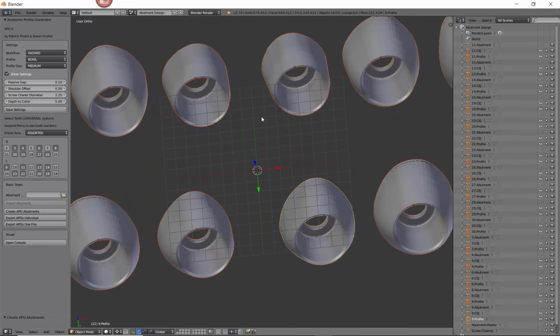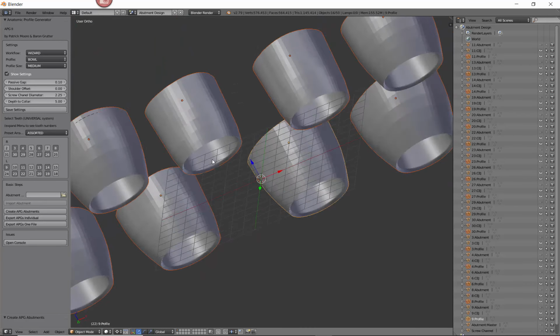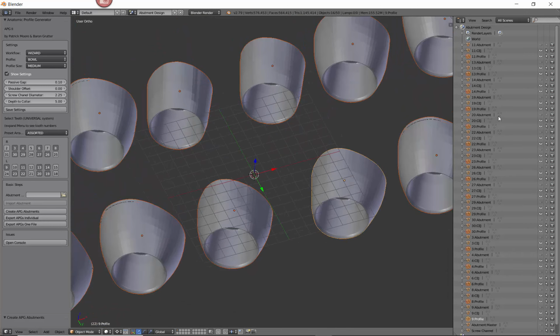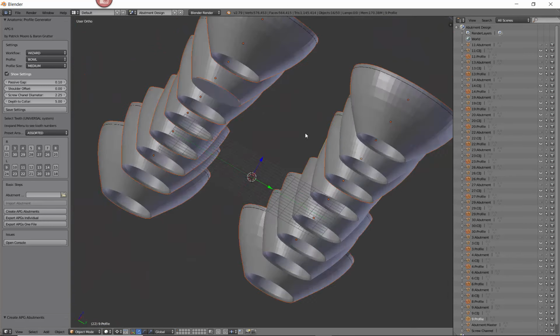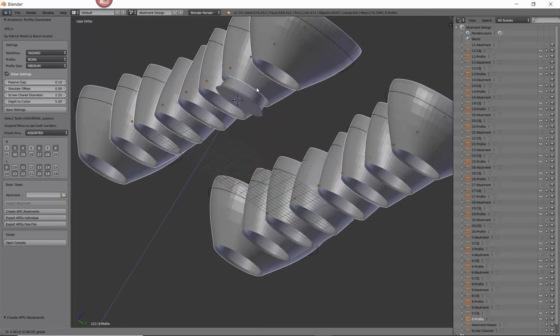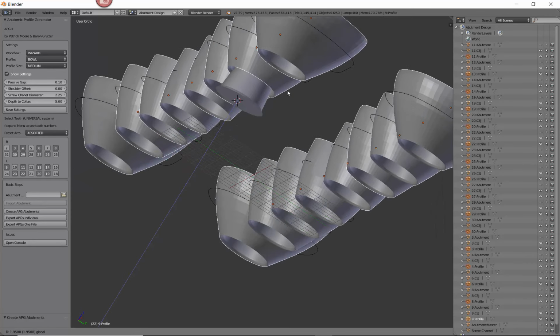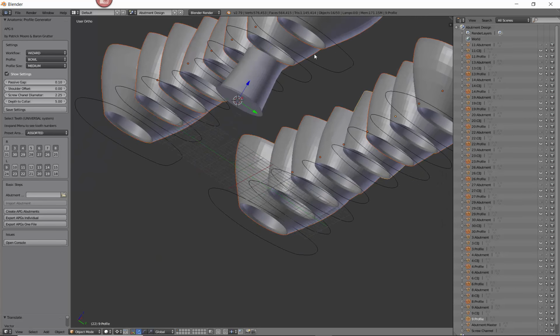And here you go. You can see the inside. You can see that sort of a taper right there. And these will all fit. If you want to see what an abutment looks like, it just slides right in there. Unfortunately, there's not much to see, but you can see how it slides on top. You wouldn't do this. I'm just kind of showing you. There's the abutment, and these all slide right over top. Okay?